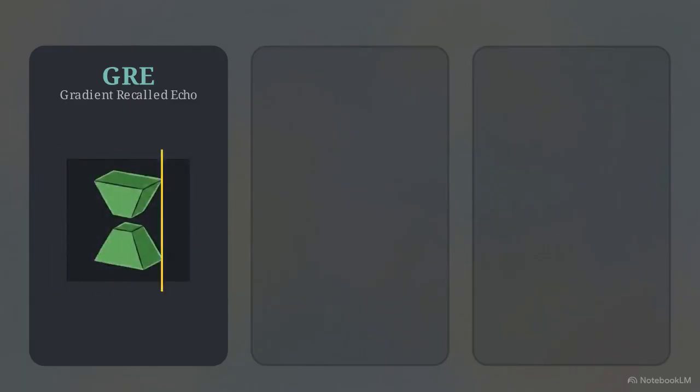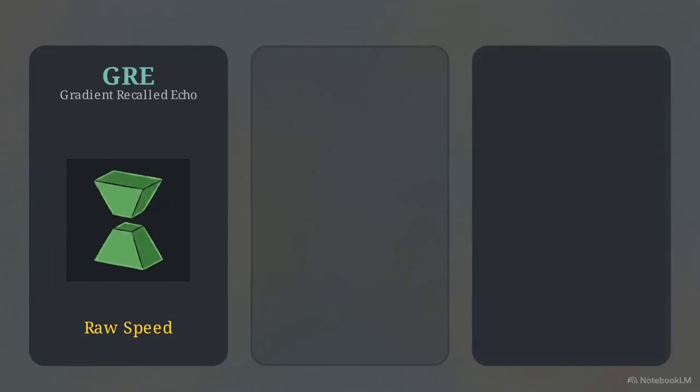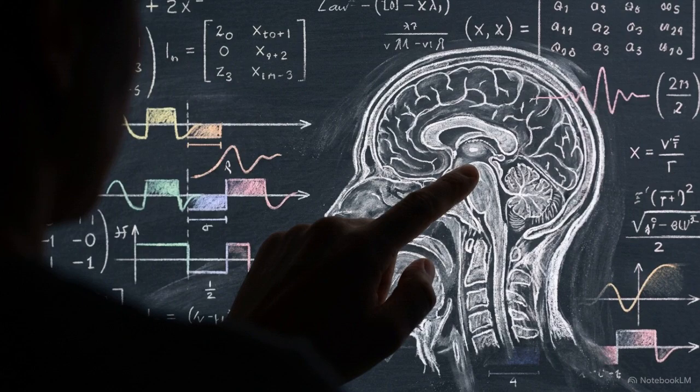These modifications show how the 5-step baseline adapts into a clinical toolkit. Gradient manipulations bypass the time limits of RF pulses for raw speed. Chaining rephasing pulses allows ultra-fast T2-weighted acquisition by filling K-space efficiently. Prefixing inversion pulses uses relaxation curves to delete specific tissues. Effective protocol management relies on precise understanding of how manipulating time, RF energy, and magnetic gradients translates physical spin states into diagnostic insight.